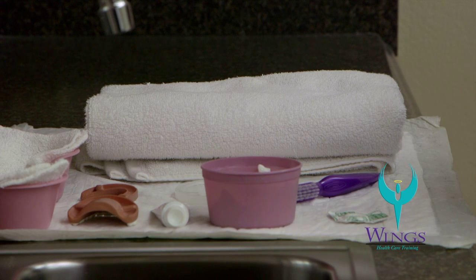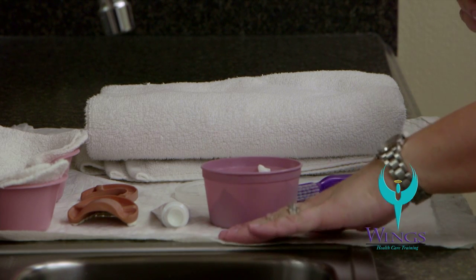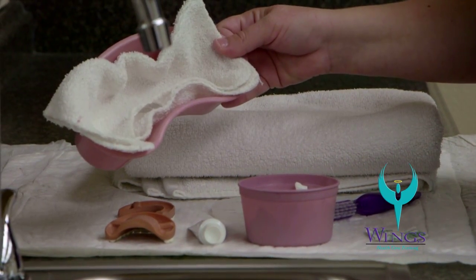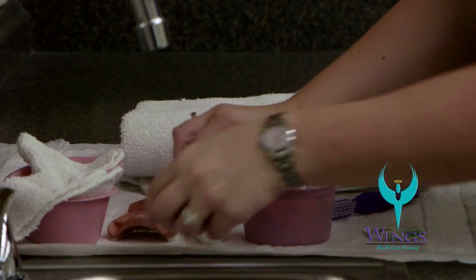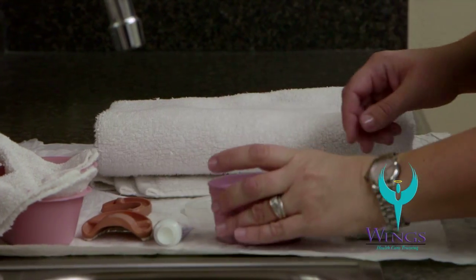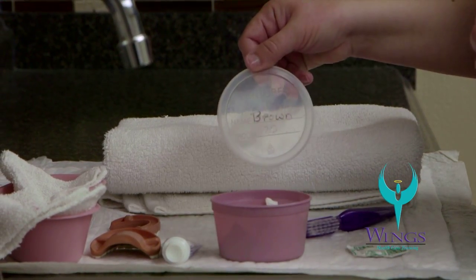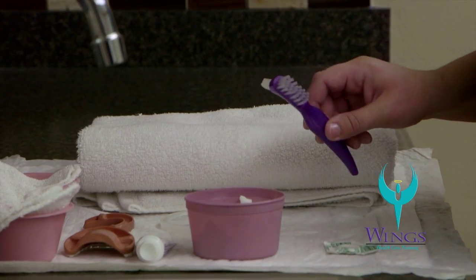The next skill we're going to perform is care for dentures. The supplies that you'll need for this skill are a waterproof barrier for your work surface, a towel, an emesis basin lined with a paper towel or washcloth, dentures, toothpaste, a denture cup lined with a paper towel that has a labeled lid, a denture tablet, and a denture brush.